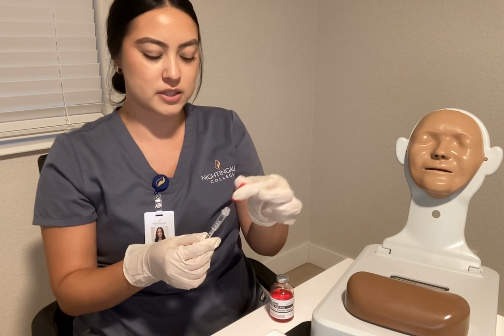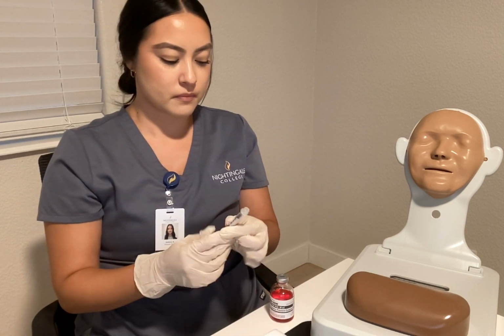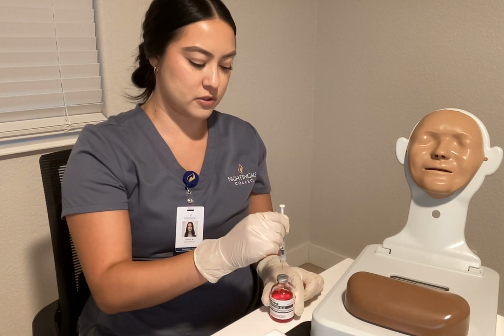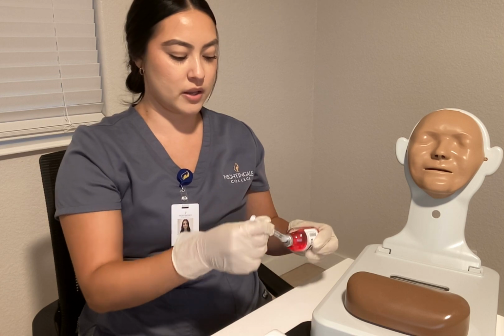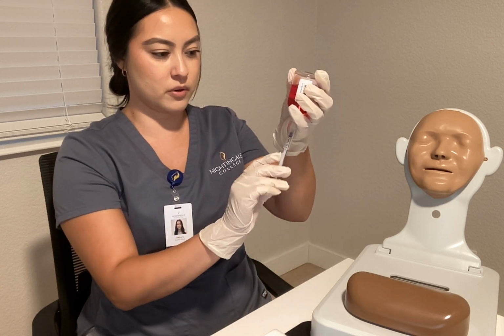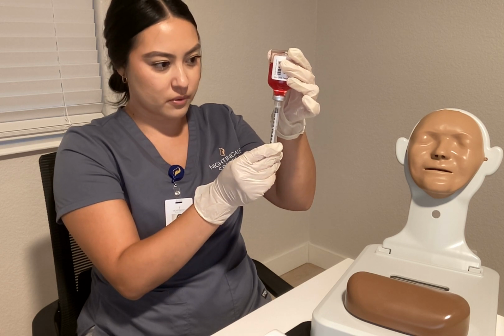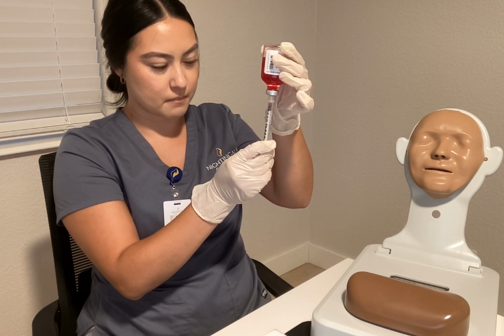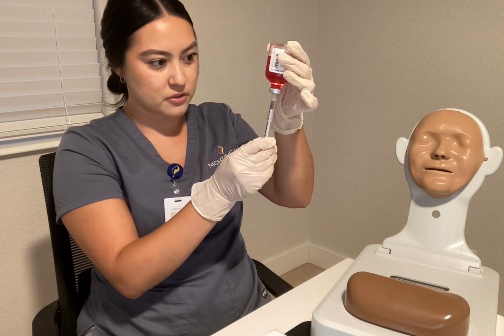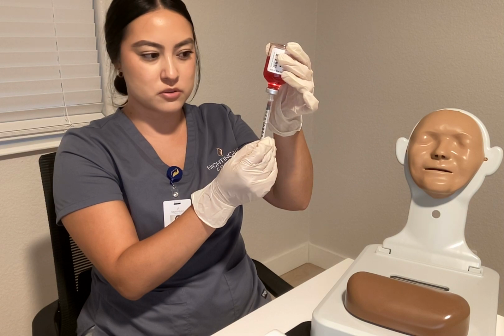So we're going to keep the cap off. We're going to place this down, and we're just going to inject into the vial. Once this is in, we're going to invert. We're going to push the air up into the vial, and next we're going to draw out 0.1 medication. I do not have any bubbles inside of my syringe, so I'm good.